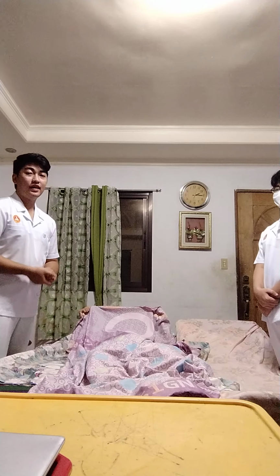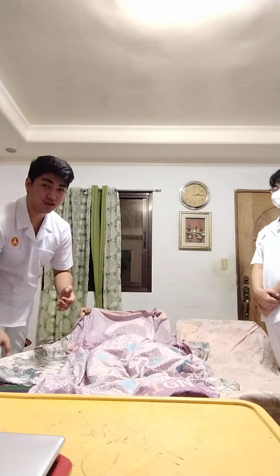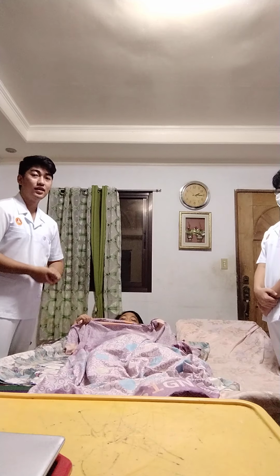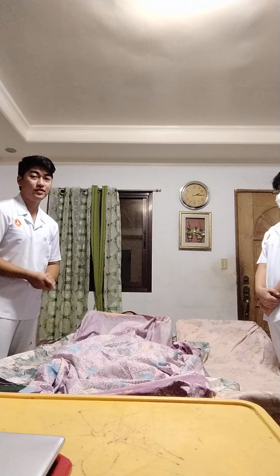And the nurse on the side of the bed without the stretcher should grasp the friction-reducing sheet at the head and chest areas of the patient, and one nurse on the stretcher side of the bed should grasp the friction-reducing sheet at the head and chest, and the other nurse at the chest and leg areas of the patient.